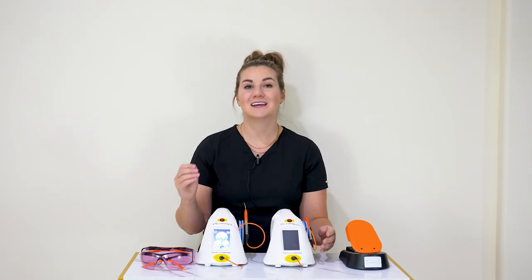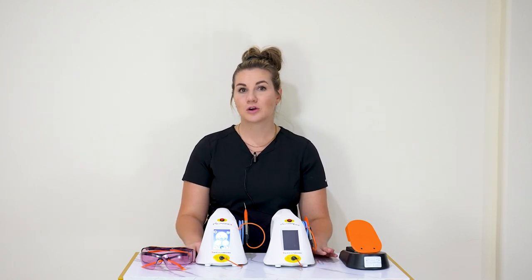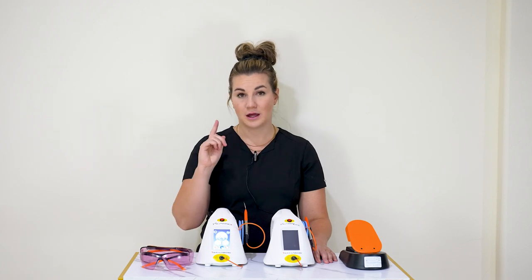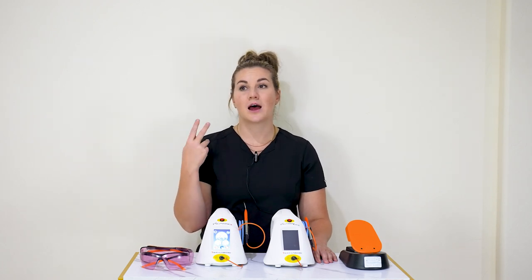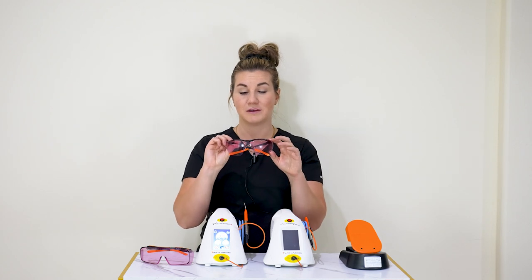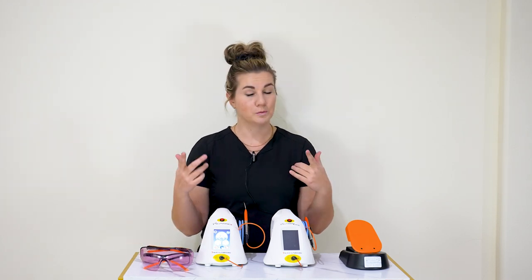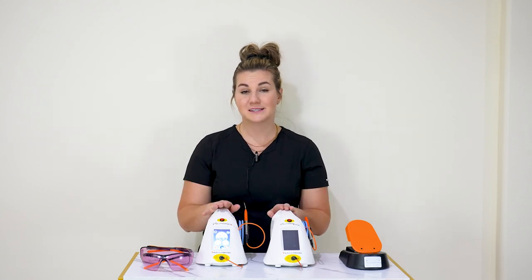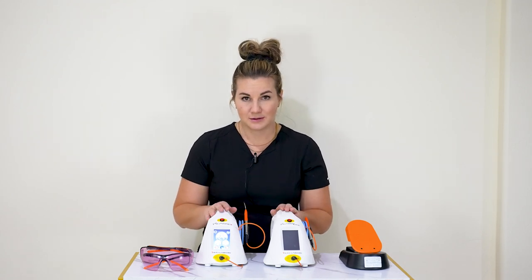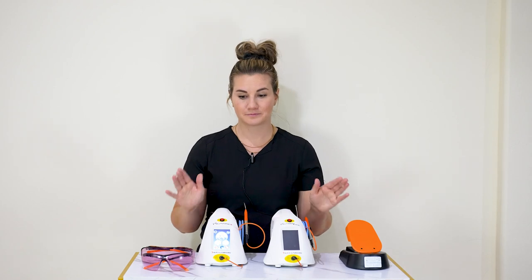We have tons of videos on our website — feel free to check them out for specific procedures. Make sure everyone in the operatory is wearing glasses: your assistant, your patient, and the doctor as well. If you are wearing loops, these sport glasses fit really well underneath loops. This is an 810 nanometer wavelength laser, so if you contact your loupe rep and tell them that, they can get you the correct laser glasses for your loops.